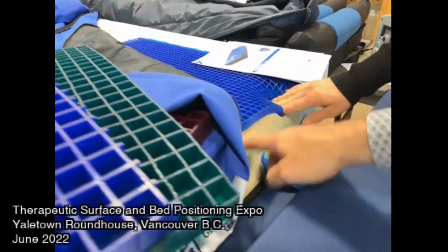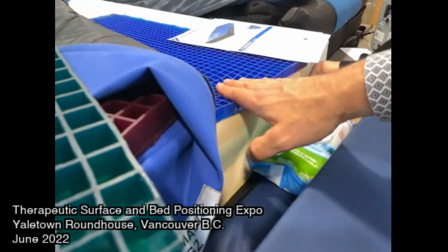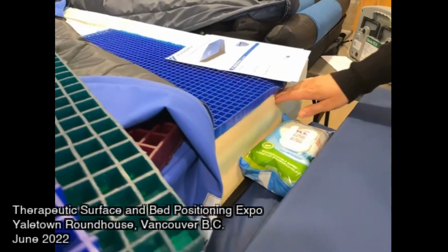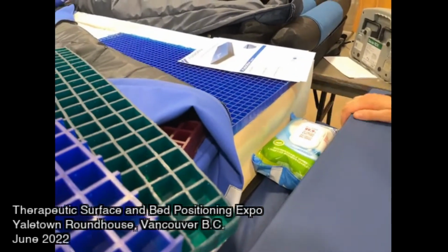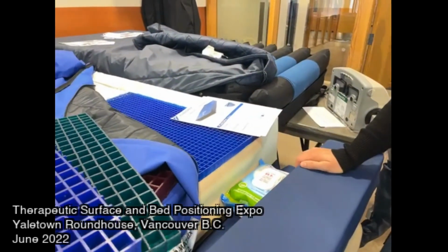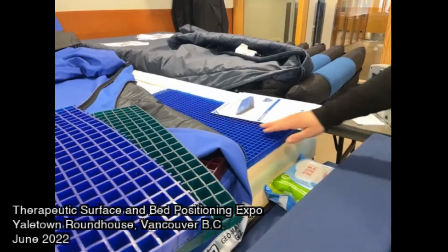This actually is changing, a different foam. We essentially have a memory foam and a pillow top gel. They do pressure map exactly the same, but it's just cheaper for us to use foam than it is gel all the way. Okay, yeah, that makes sense.